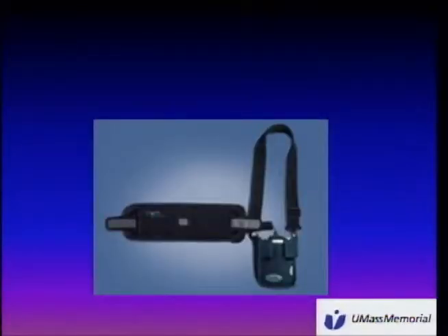And this is what the transmission arrangements have now been reduced to, simply because we've now got 3 sensors here instead of 8. The recording device and battery pack are in this simple shoulder pack here, which the patient can easily go to work with. It's an 8-hour study in general, and patients can simply pick up the device early in the morning, swallow the camera, come back late in the afternoon, and have everything downloaded.